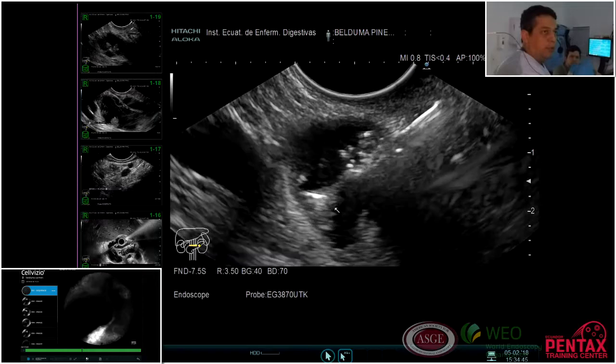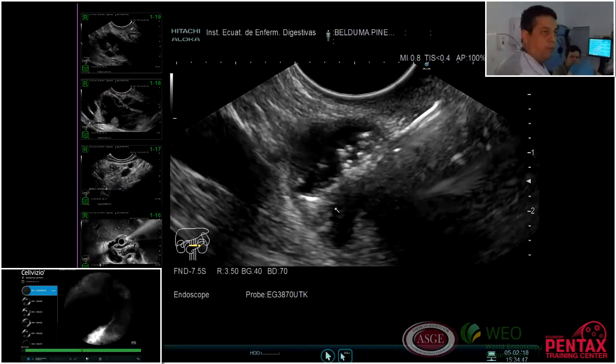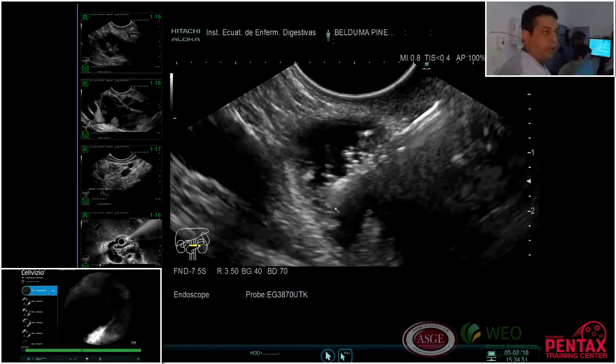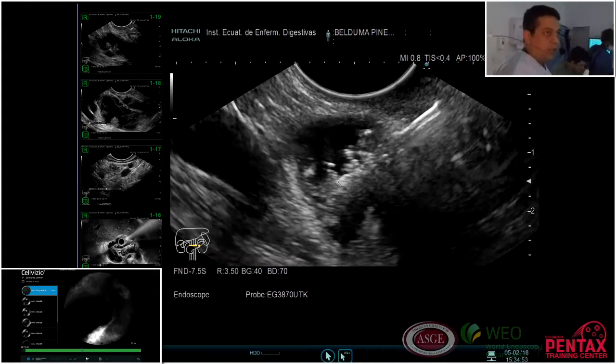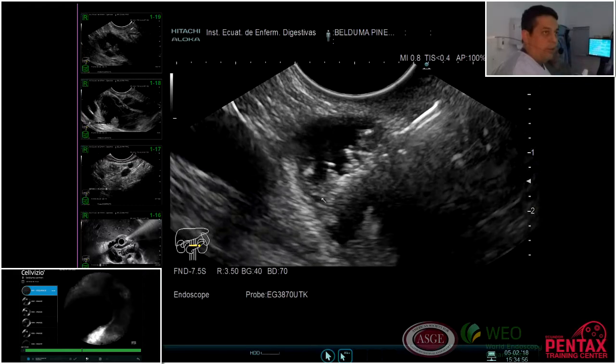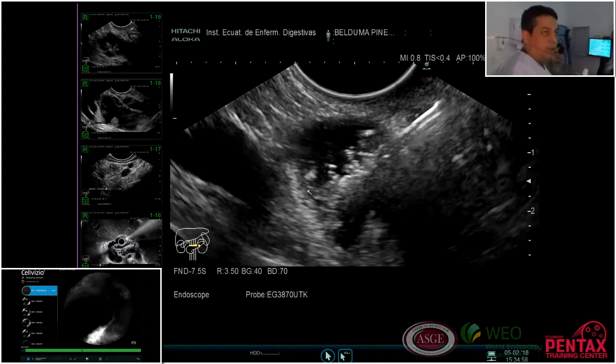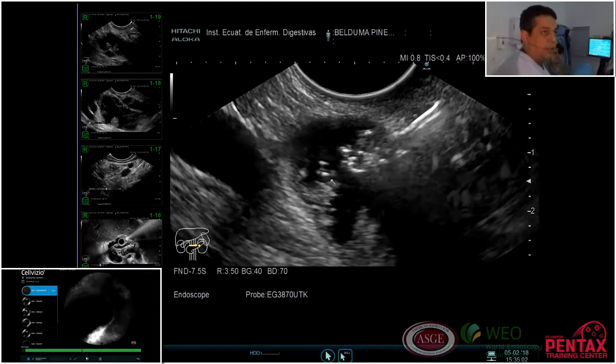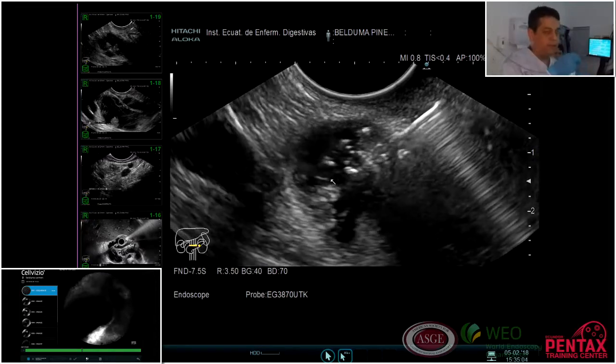Okay, so this could be very good for the pathology analysis. Cierra, you see here. So we are taking just in the tisular area that is very suspicious for malignancy in these kinds of cases. Okay, toma.